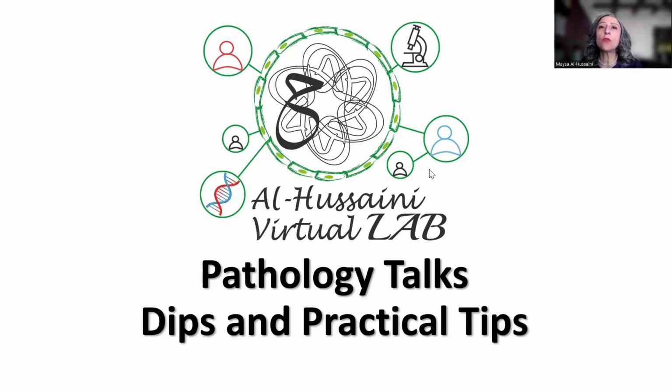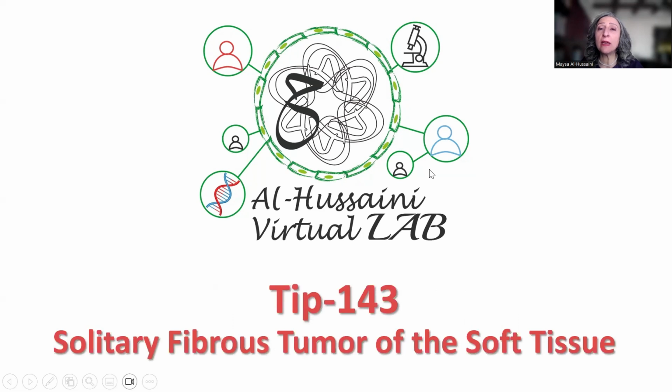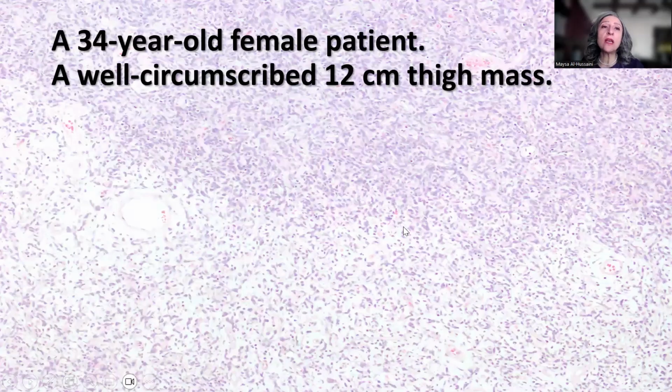What I'm going to be sharing with you today is a nice example, courtesy of Dr. Imam Hijazi. This is a case of solitary fibrous tumor of soft tissue. So this is a case of a 34-year-old female patient who presented with a well-circumscribed 12-centimeter thigh mass.